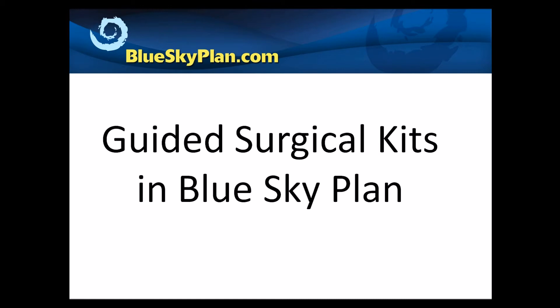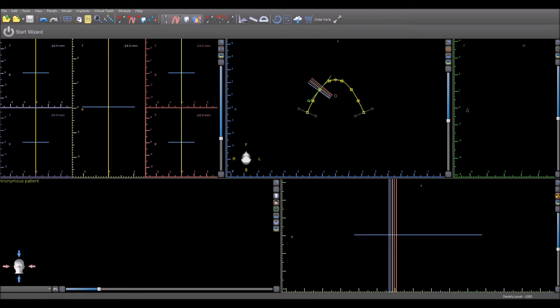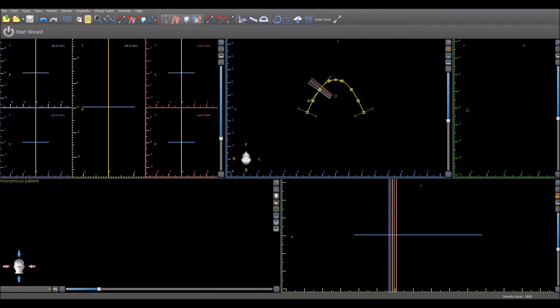or enter any measurements when creating surgical guides for non-Blue Sky Bio guided surgical kits. First we will demonstrate how to use the guided surgical kits in the wizard and then we will discuss the additional surgical kits in the normal and advanced mode.